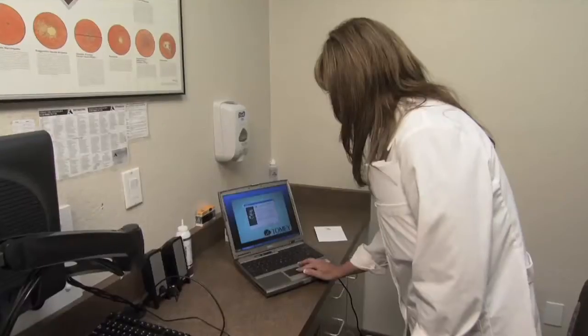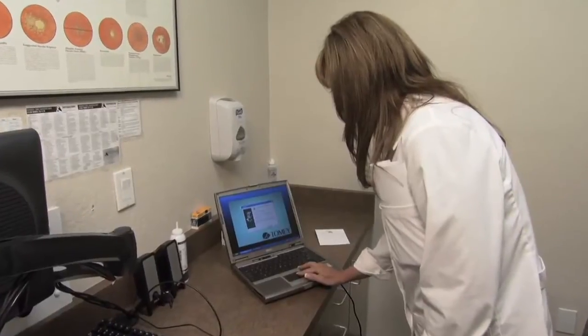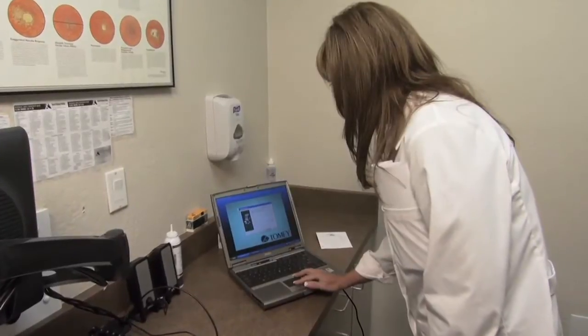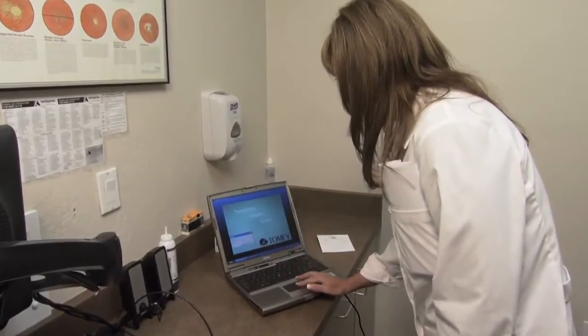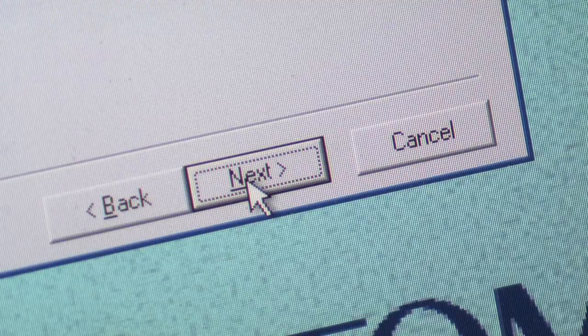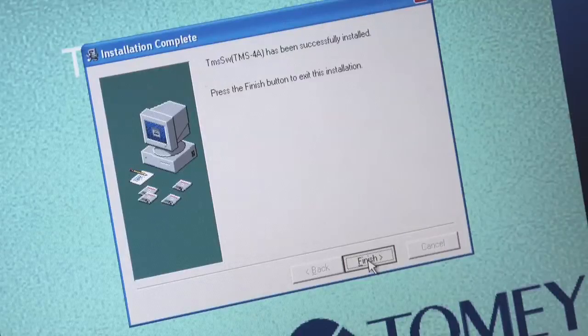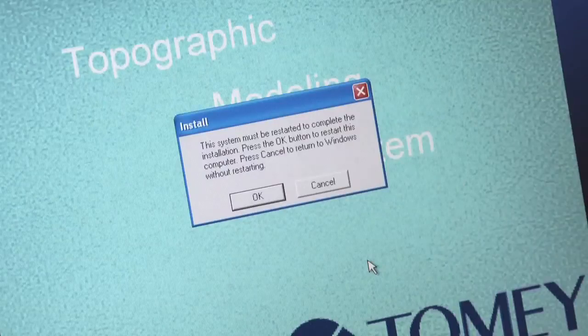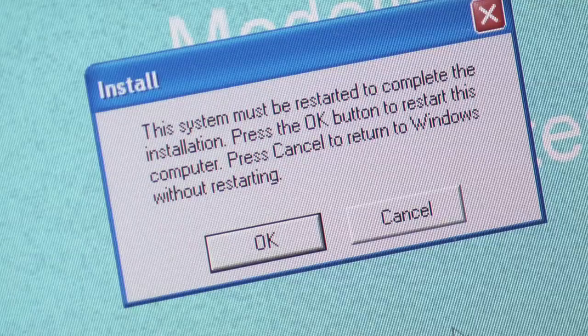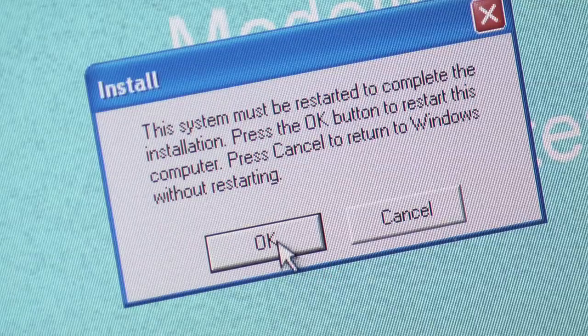You will now be able to install the TMS4 software. Click Next. Click Finish. Click OK to restart the computer.